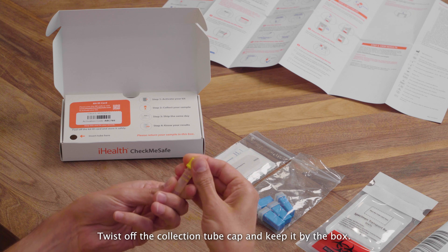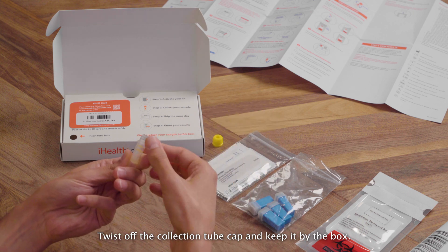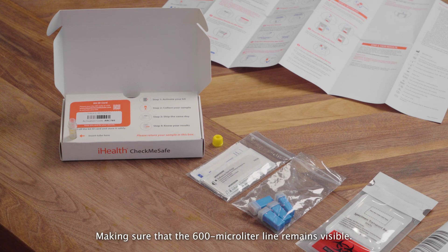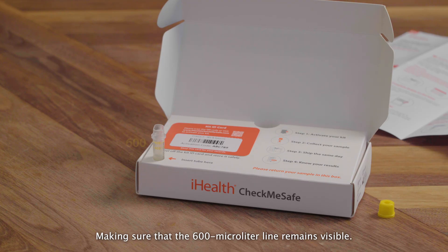Twist off the collection tube cap and keep it by the box. Place the tube inside the hole on the box insert, making sure that the 600 microliter line remains visible.